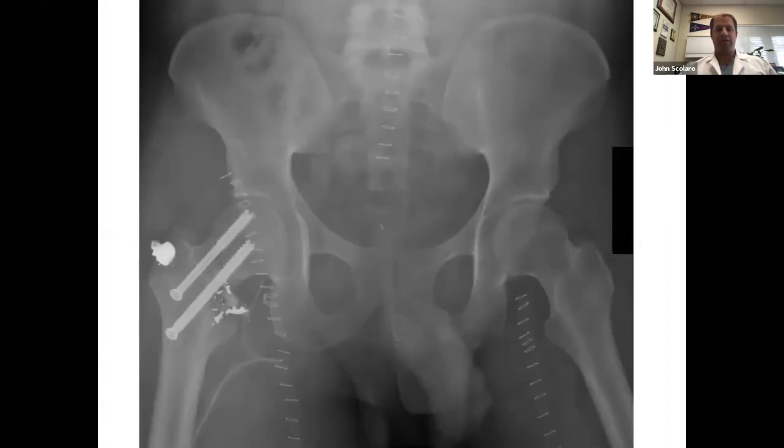And these were the final radiographs. You can see the X-flap staple line, the midline, and the two groin staple lines from the vascular surgeons. We had this lateral view obtained, and then a CT scan was obtained as well and showed us this reduction. This is an axial cut, a selected coronal CT cut, as well as the 3D rendered CT cut. And so we were actually pretty happy with this.